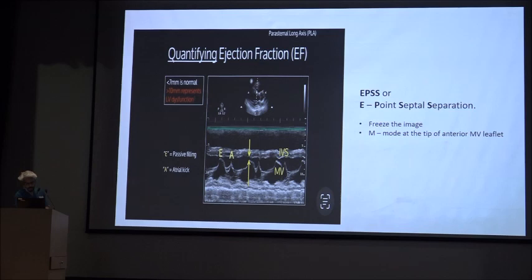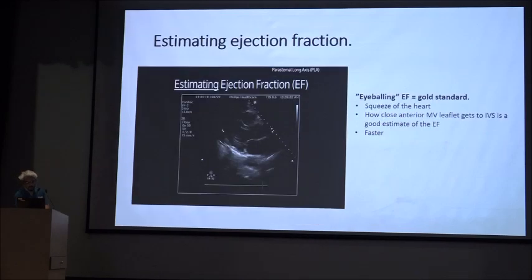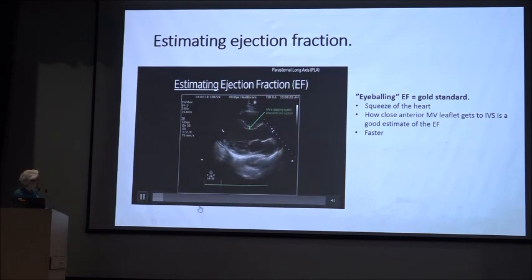As we have noticed, if you want, I can play the video again. In this the mitral valve flaps twice. If you can see, in one heartbeat it will flap twice. So those are the two curves on the graph. One is basically due to the passive filling, and the other is due to the atrial kick.